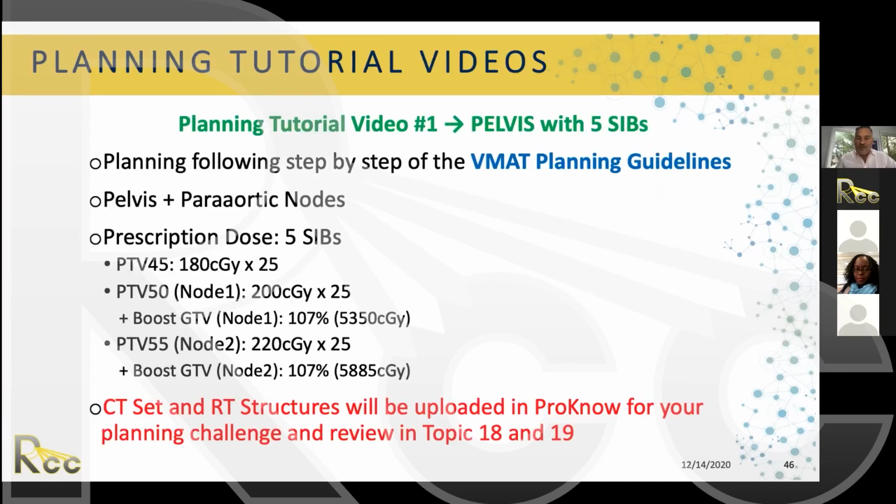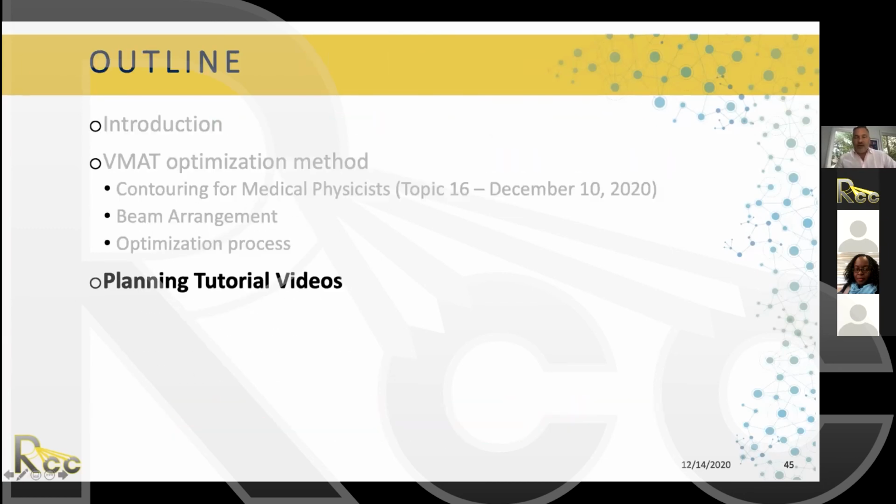I have a few more slides to go. As I said before, it's complicated to present the optimization on a presentation as we did for contours last week, however many pictures we put in the talk, but it's easy to visualize if we have a live planning tutorial. So we created these planning tutorial videos for some sites.